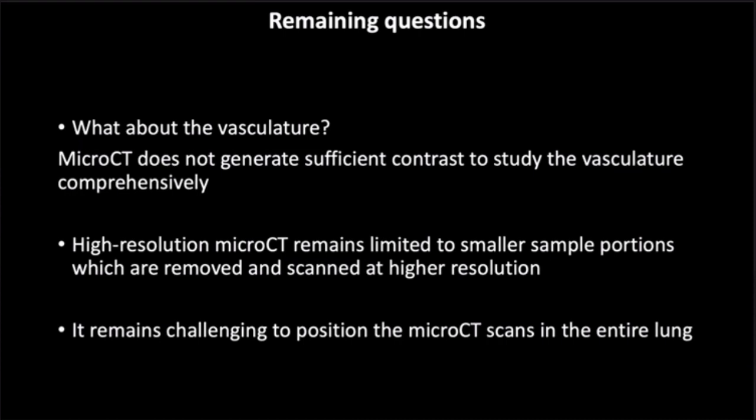And lastly, and also a very important thing, is that it remains challenging to reposition the micro-CT scans back to the entire lung. So we have to physically and mostly align ourselves manually, everything back together, which is a quite tedious job.